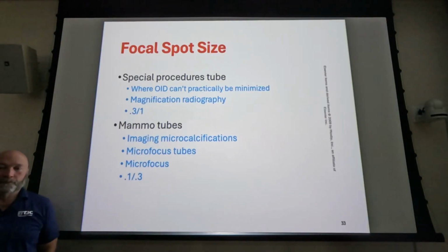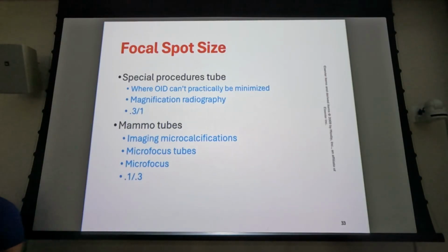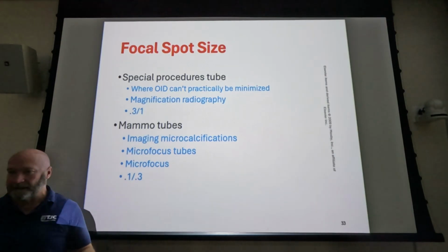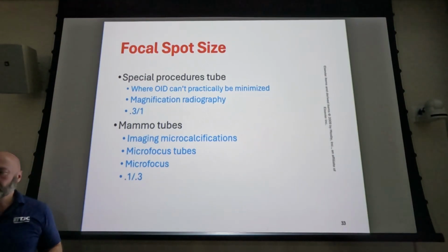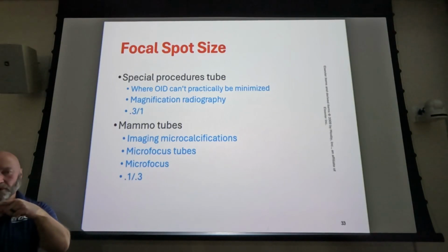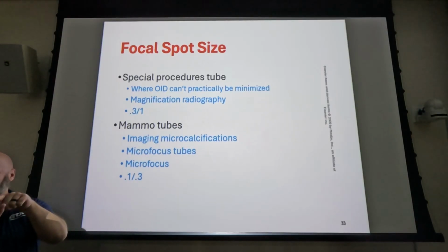But in special procedures, in a lot of cases, they'll use C-arms, and for convenience, as much as anything else, they will put the patient's anatomy right in the middle of the C. Part of the purpose is that if they're perfectly aligned in one plane and the anatomy is dead square in the center, if they go to a lateral, it's still in the center, right?